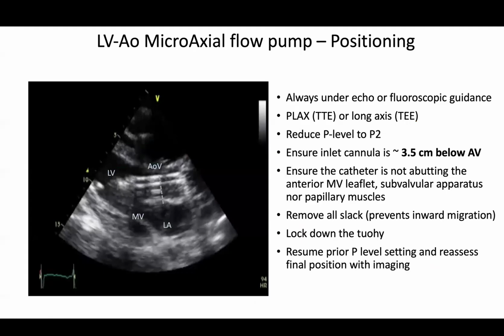How to assess Impella positioning. It's very important that you know your landmarks in echo, both as a CCU fellow or an interventional fellow, because you're the one getting called to the bedside to look at these things. If you're getting called, someone has in their mind that the Impella has moved. That doesn't necessarily need to be the case. So you need to look at these landmarks very clearly and identify them so you can decide whether it needs to go to the lab or be pulled at the bedside or whatnot.